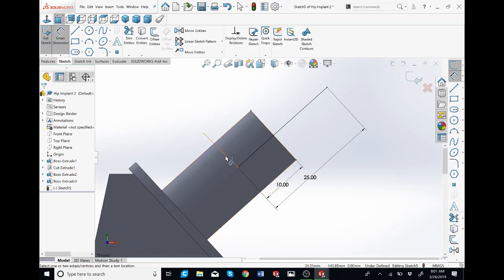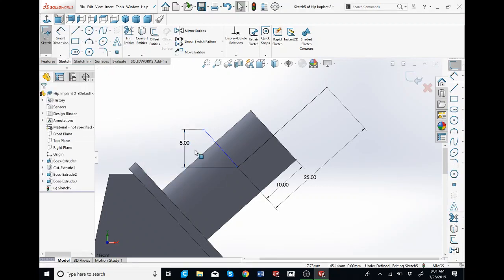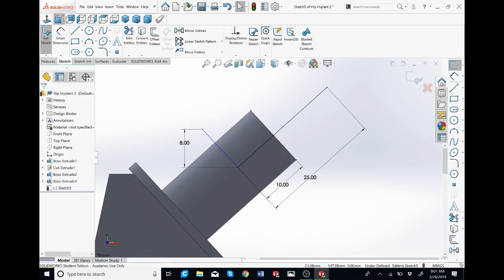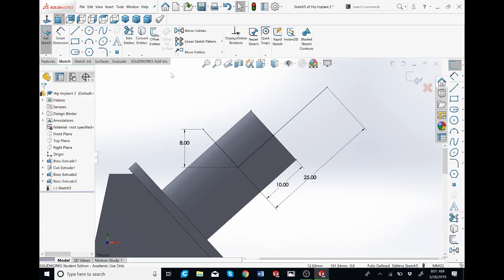I'm just clicking S key, clicking on smart dimension, making sure it's actually vertical this time, and clicking 8. You see that it moves because the white box shows that it's not really making the relation. It's just showing as a reference. So I'm going to click on this, hold Control, click on this line, and then make it perpendicular. And now it's fully defined.